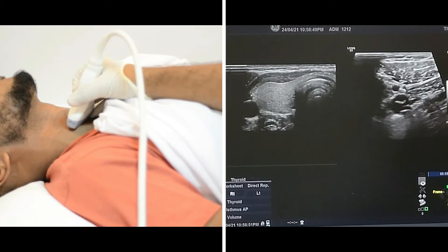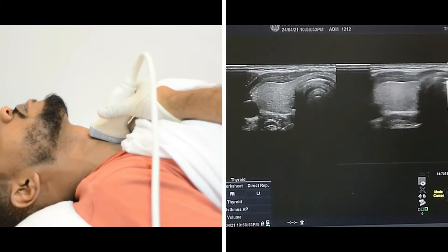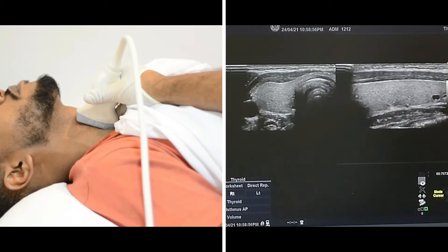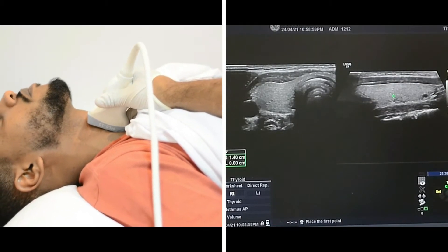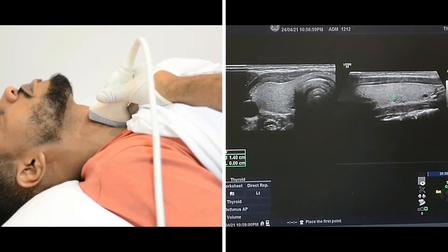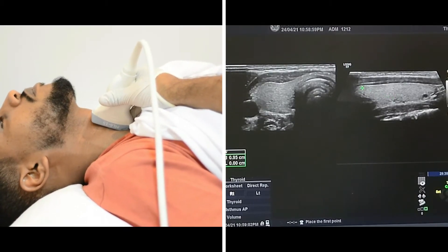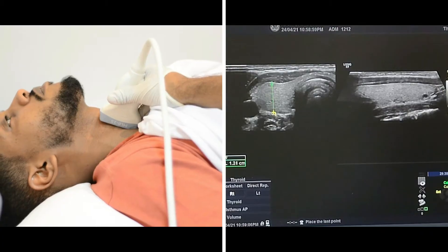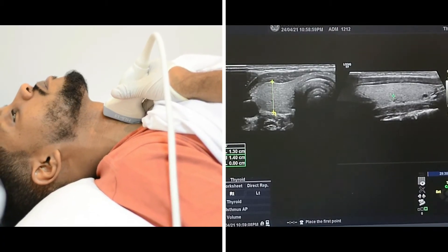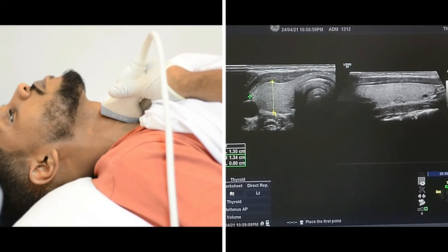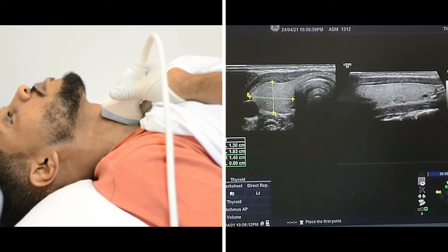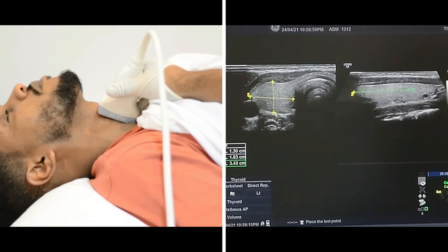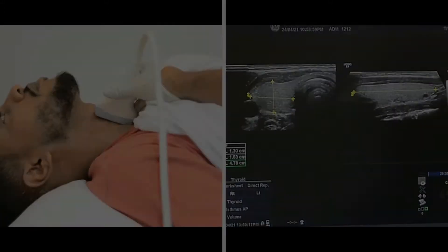Now I'm going to split the image to measure the right lobe size — here in the transverse plane and here in the sagittal plane. Whatever measure you use — volume or just three diameters — from the transverse plane, measure the AP and transverse diameters, and then from the sagittal plane, measure from superior to inferior the length of the thyroid.